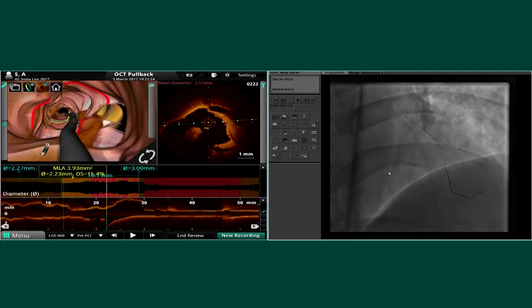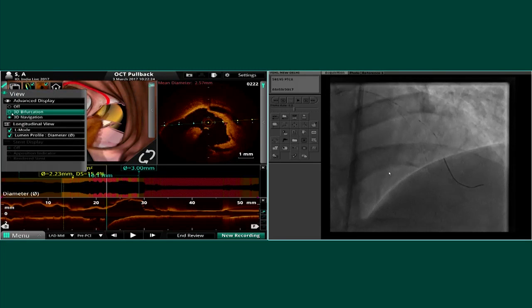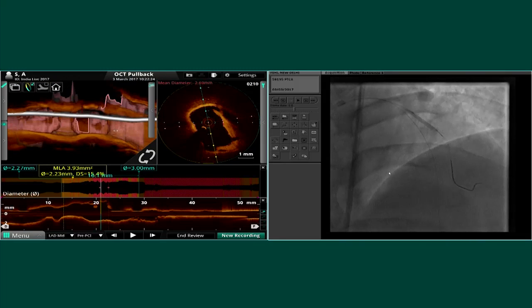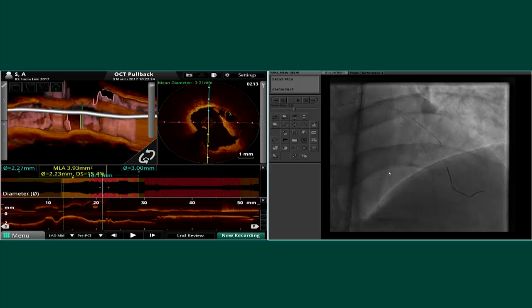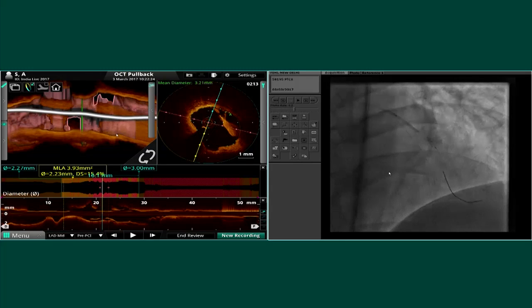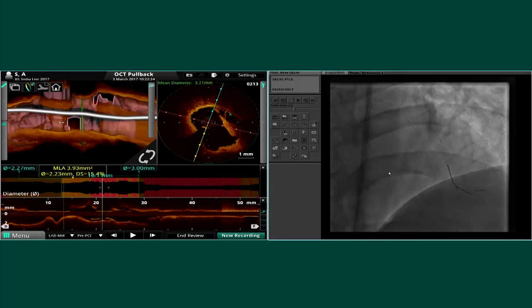Okay, from here was the disease process, so let's go up here. 4, 6, 8, 10, 12. Deflate. And 4, 6, 8. 2 millimeter balloon, deflate. So let's see, hopefully we got the diagonal back.